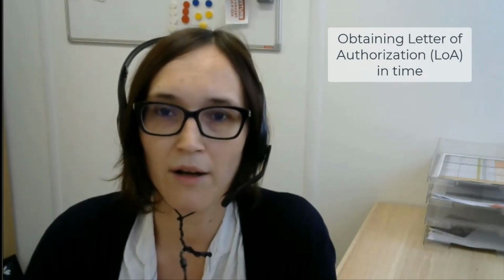Yes, our panel of samples included also one quarantine virus. This was Chrysanthemum stem necrosis virus. Therefore, a letter of authority was required. I must say that some labs had big problems with getting the letter of authority in time. And I think that one lab was even not able to get it, most probably due to the COVID epidemic.